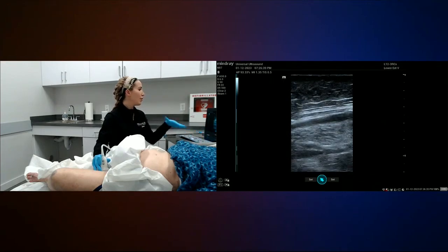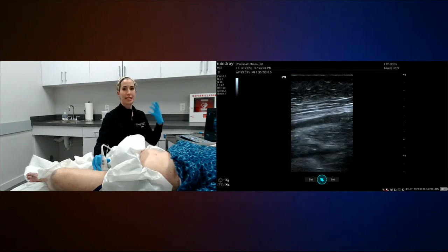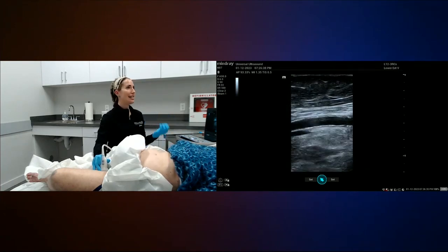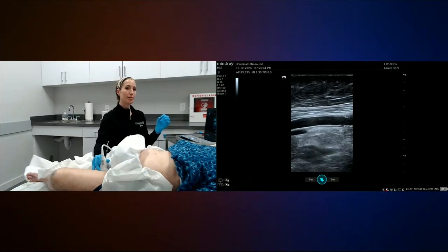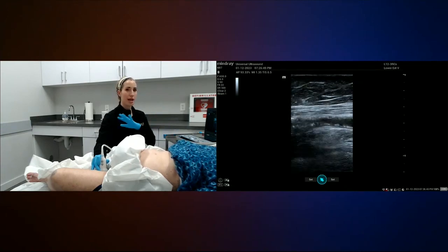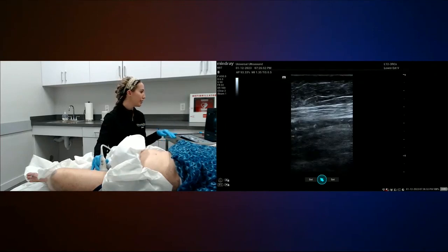And also, when veins begin to heal, we know that the diameters are big because they compensate that 90 to 95% of that blood flow back to the heart. So as the vein heals, the walls become thicker and the lumens become narrow. And it's called post-thrombotic luminal wall changes. Sometimes it revascularizes and sometimes it stays completely occluded. And in Barbara's case, is completely occluded.